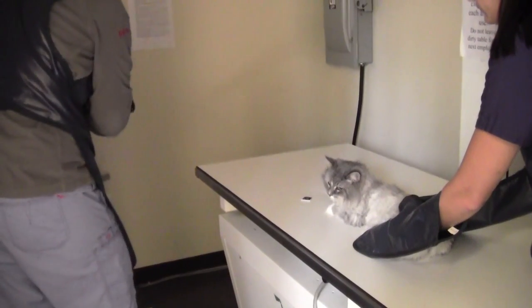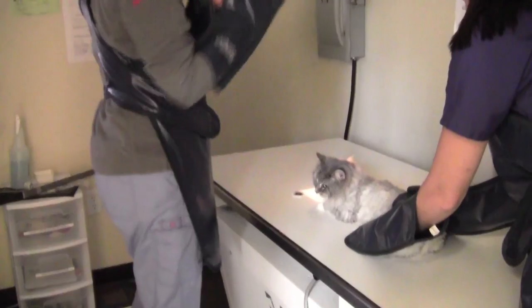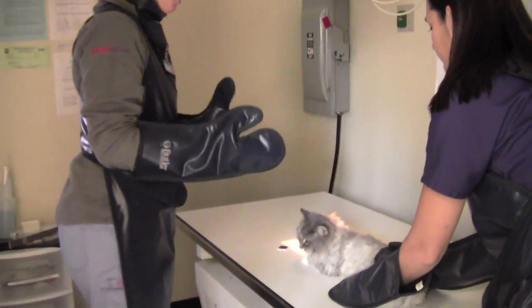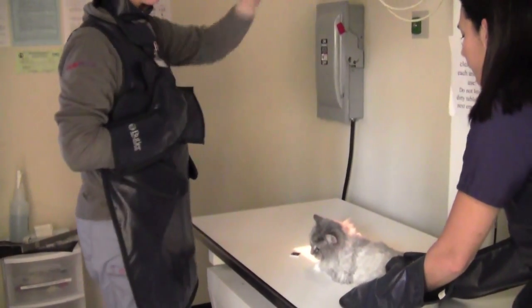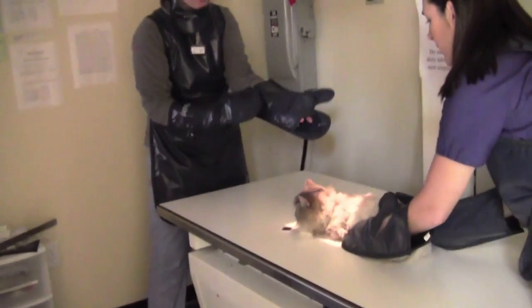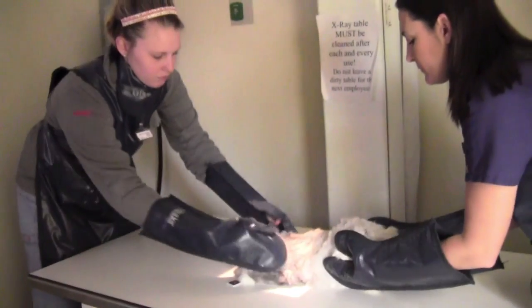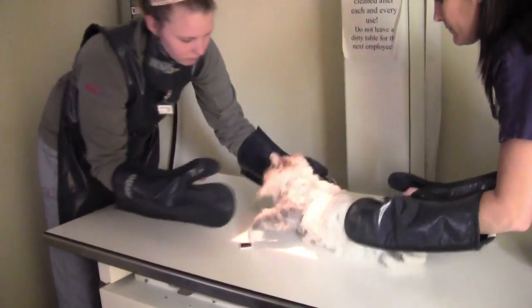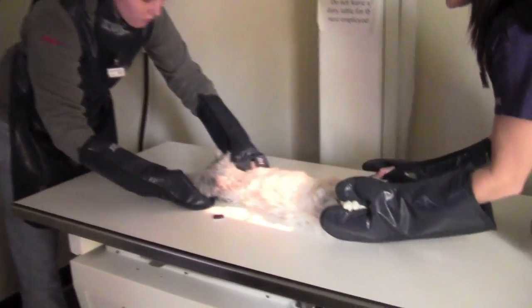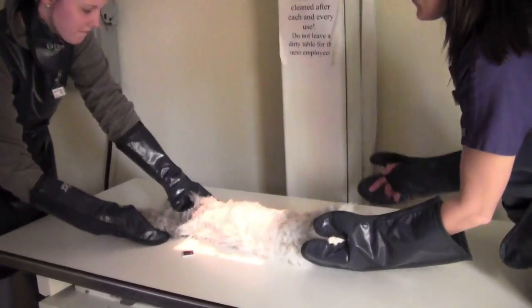The best position to evaluate the heart is dorsoventral, and ventrodorsal is best used to evaluate the lungs. For lateral thoracic X-ray, the patient should be placed in right lateral recumbency with forelimbs extended cranially and hind limbs pulled caudally, and the neck should be in a natural position.